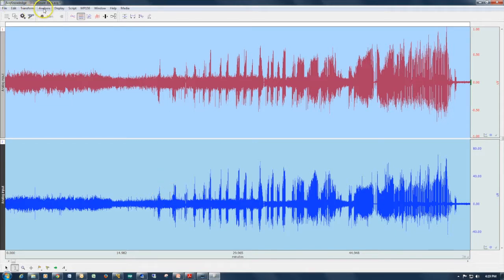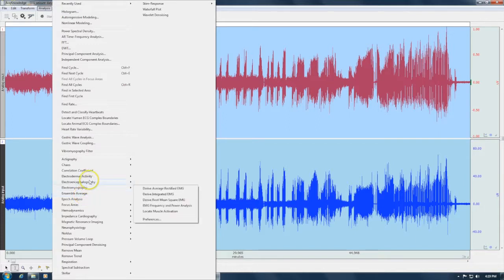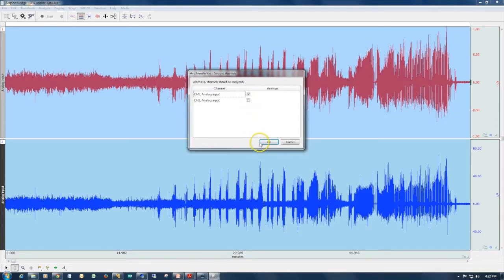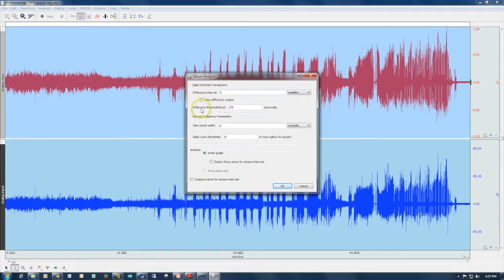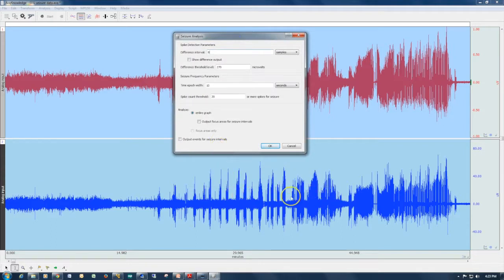The actual analysis is located under the EEG menu and is labeled Seizure Analysis. I'm going to run the analysis on channel one, which contains the raw signal. The software will perform a difference similar to the one already run on the difference channel. Looking at the difference channel, we can see a threshold of 40 will pick up a number of spikes, so I'm going to set this value to 40.